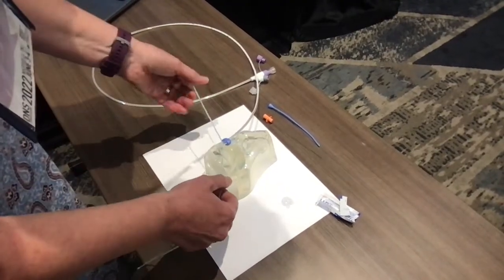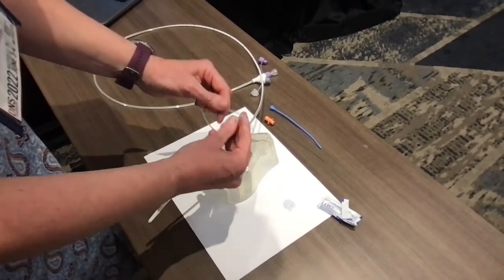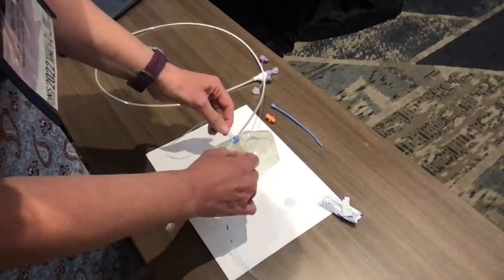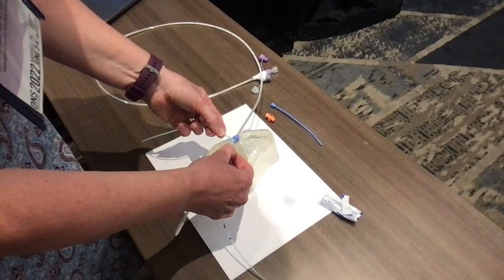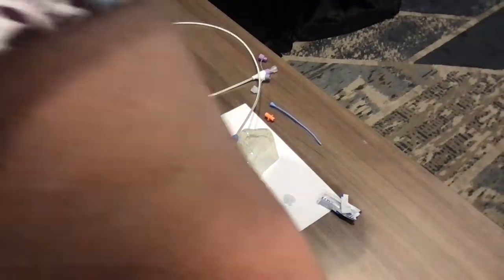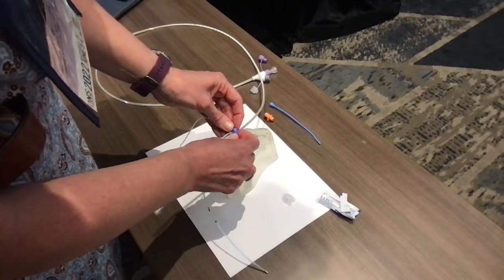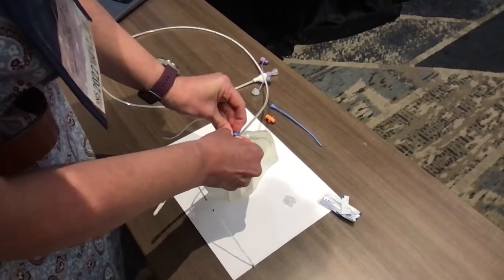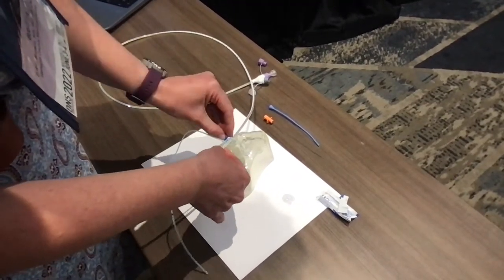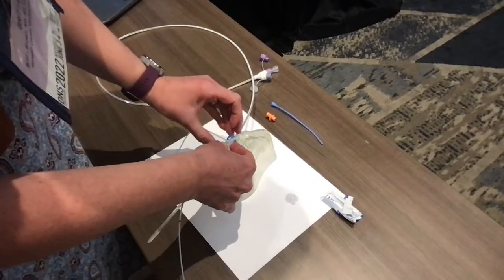After you've done that and you're happy with where the tip is, you can do a simple square knot to secure the end of the clip. Tie that, and then you're able to clip the tails off with a pair of scissors, and you'll be all set. If you need to reposition the feeding tube later, you can use a product that comes with the bridle or just use your fingers to open the clip, disengage it, adjust the feeding tube as necessary, and then re-secure it once the feeding tube is placed. And that's how you place the nasal bridle to secure a feeding tube.